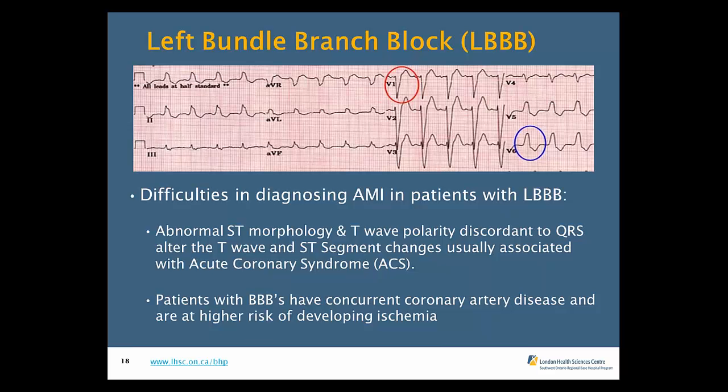But the more ECGs you do, it becomes almost pattern recognition, where this can flash up in front of you and within 2 seconds you can look at it and say, this is a left bundle branch block. So, the old adage, practice makes perfect. It's absolutely true, and you're training that muscle memory to look at these ECGs and notice the patterns. That's what a lot of ECG interpretation is. It's exactly pattern recognition, and by practicing, you train your brain to see these patterns and quickly diagnose things. Thanks, Matt.